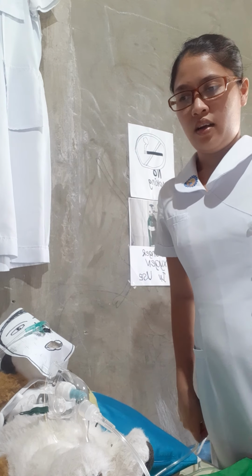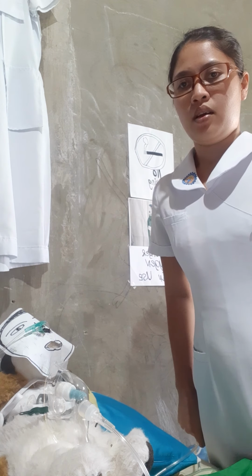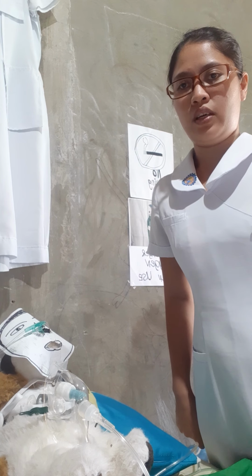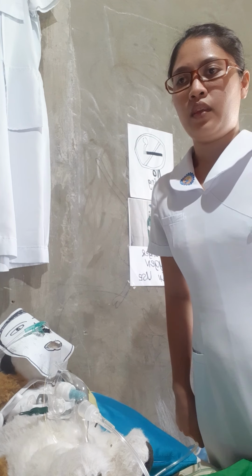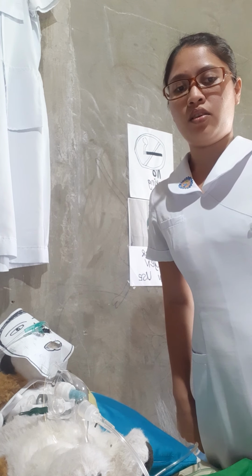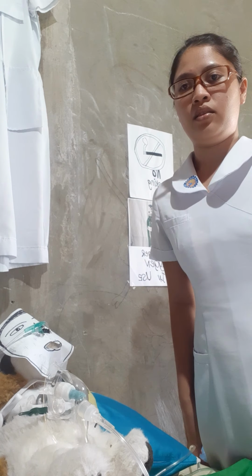providing tracheostomy care. The purpose of this procedure is to maintain airway patency, maintain cleanliness, and prevent infection from the tracheostomy site, facilitate healing, and prevent skin excoriation around the tracheostomy site, and to provide comfort.